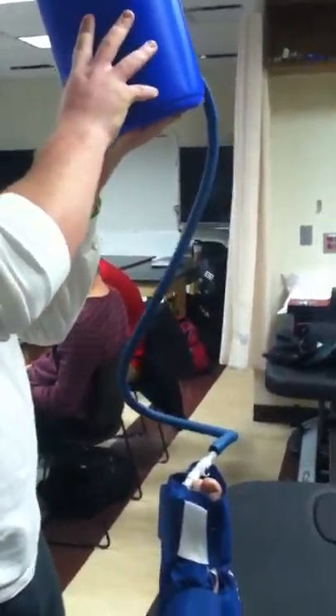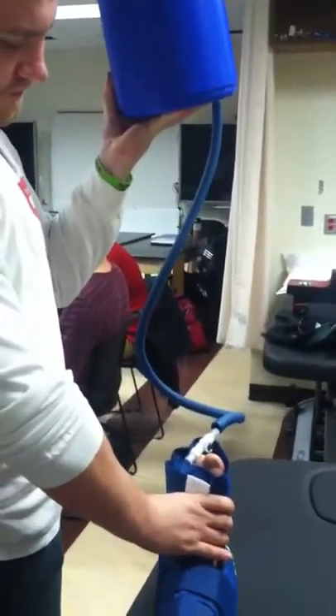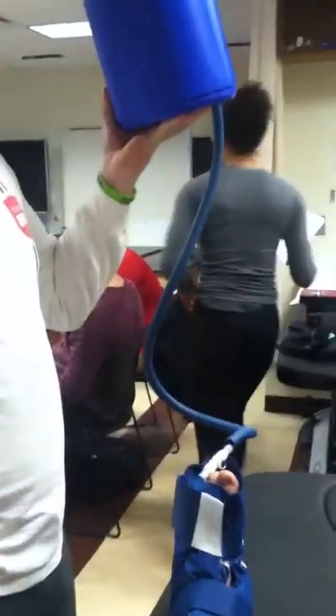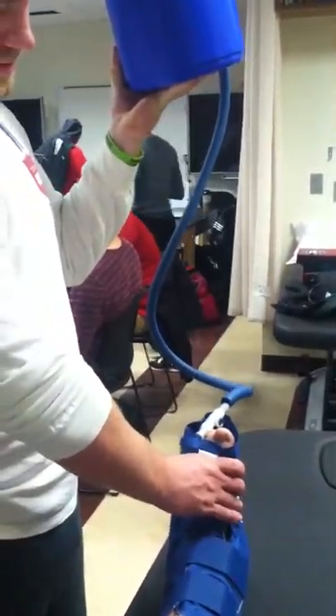Let me know when you start to feel it. I feel it. You're starting to feel it? Okay, you let it go until it's tight enough.